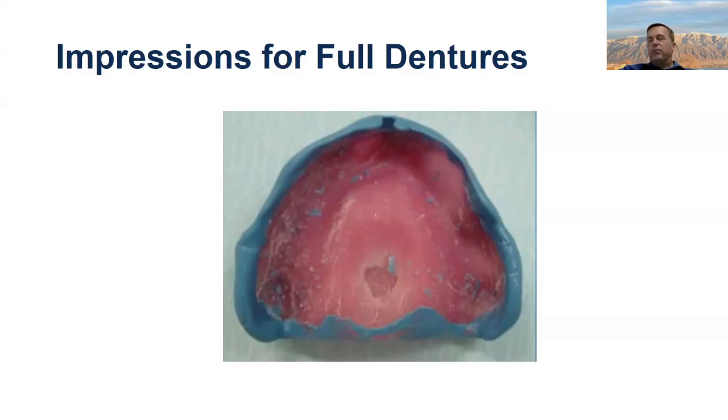Just make sure you leave enough material because you don't really want to burn through to the putty. You want a nice uniform thickness. When you're all done, except maybe at the edges here, because this kind of works like your stop, you'll want to see the light body material all over. Good trick. Thank you. Boy, we got a lot of good tricks today.